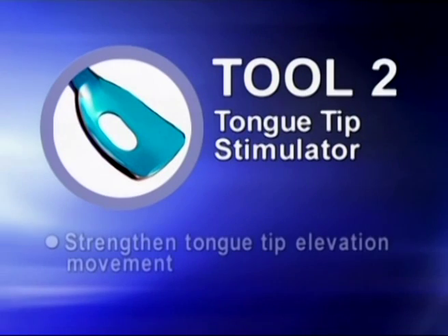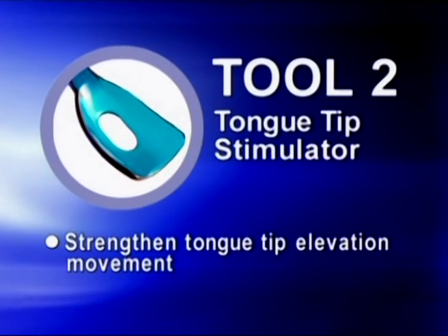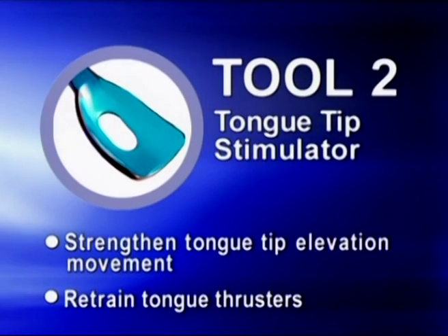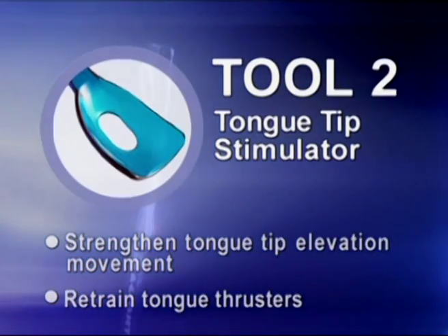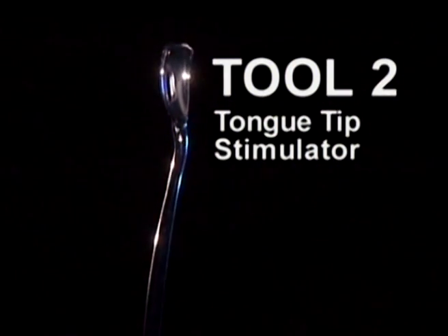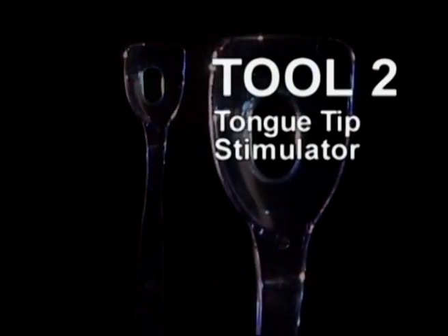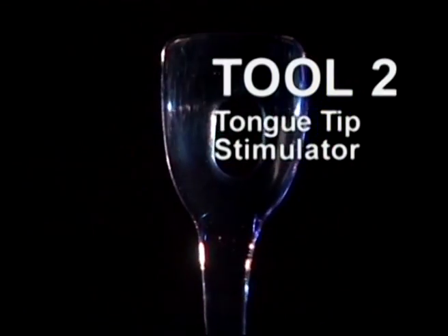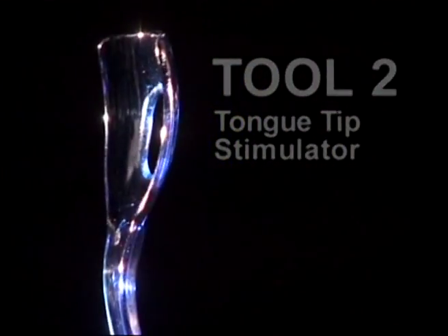Tool number 2 is designed to strengthen the tongue tip elevation movement to the palate. Tool number 2 is also used to retrain tongue thrusters to reposition the tongue tip inside the mouth on the palate behind the front teeth. Note the hole opening in tool number 2. This helps the patient feel where the tongue tip should be placed, guiding the patient to position the tongue tip on the palate behind the front teeth when speaking and swallowing.